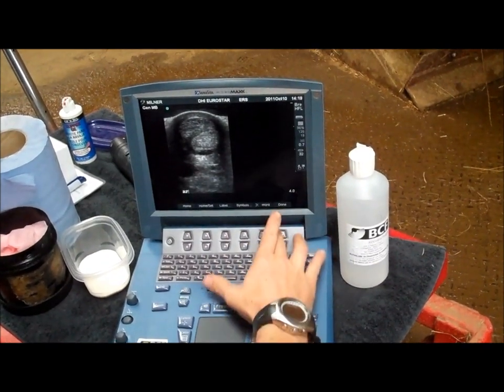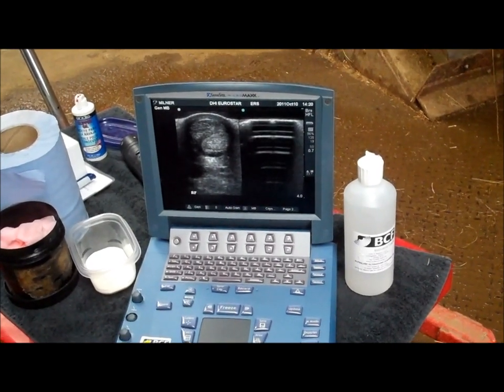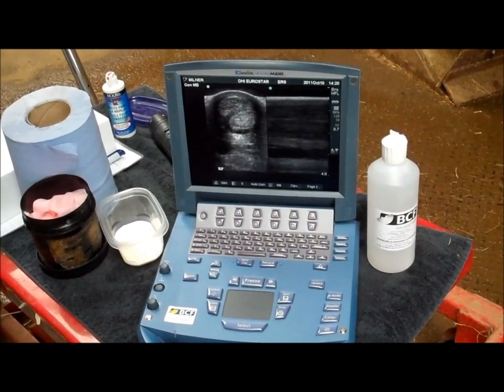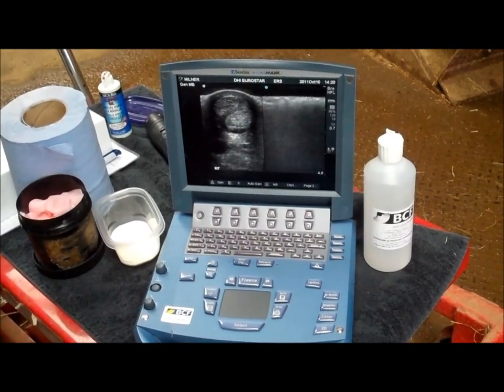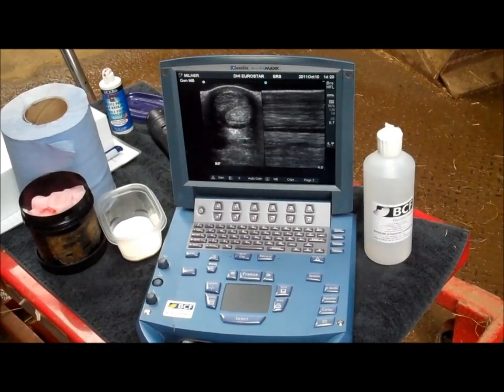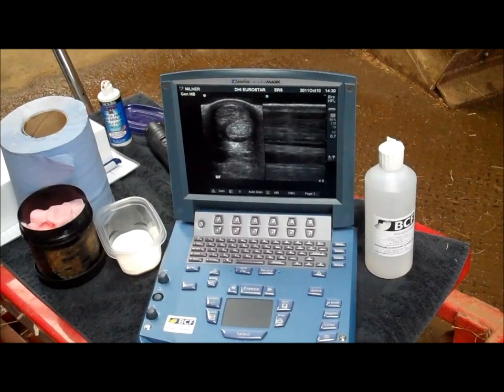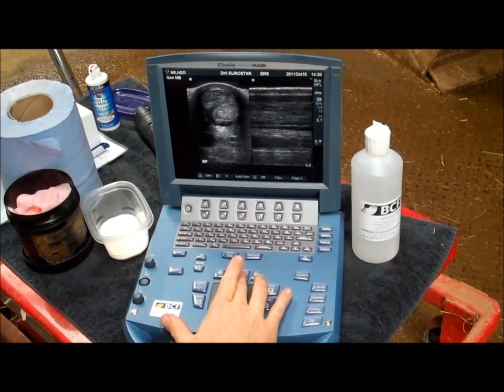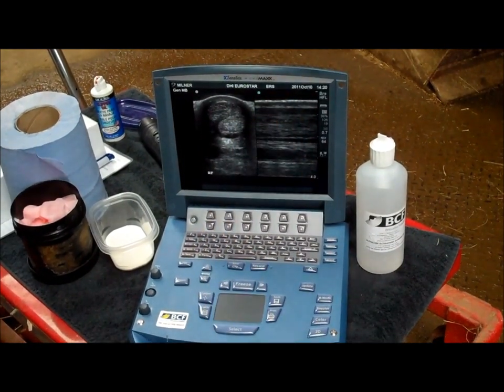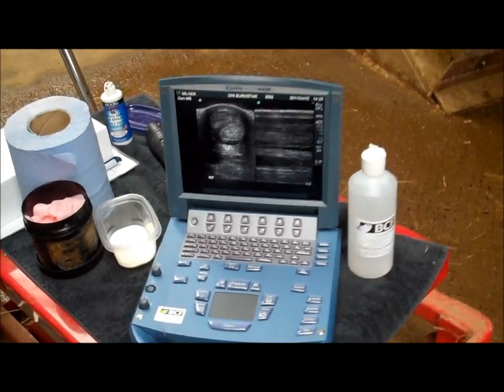We can update the image and then take a longitudinal section in the same plane — same leg, same side, just a longitudinal section. We have a marker at the top right-hand corner to mark lateral and proximal. I can freeze the images together. I have all the client information programmed in and can add additional information for the veterinary surgeon performing the test. Then I can save that image. Simple.